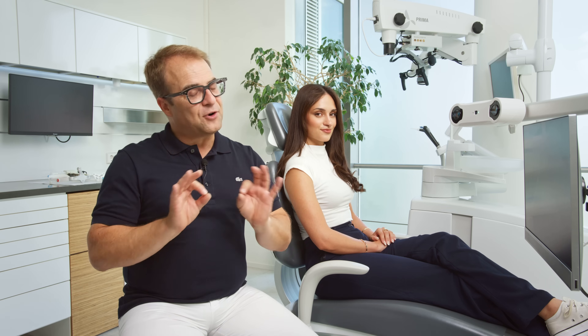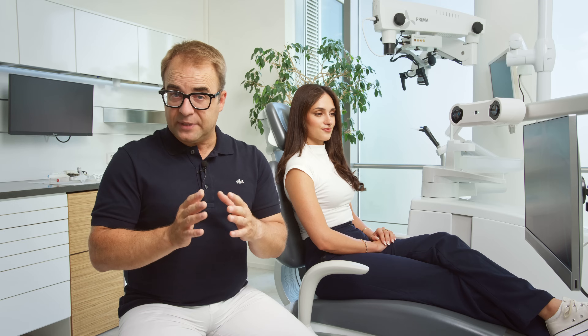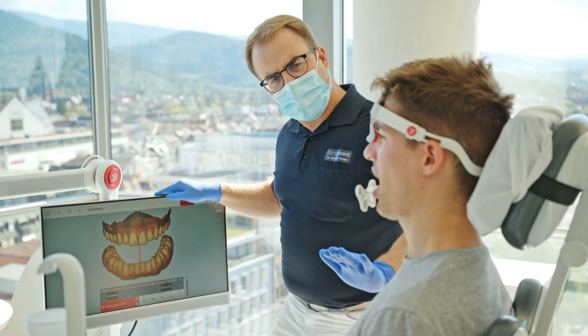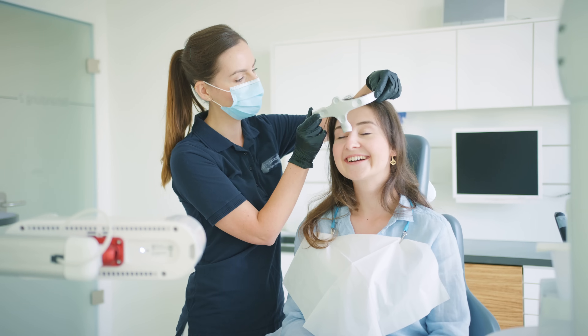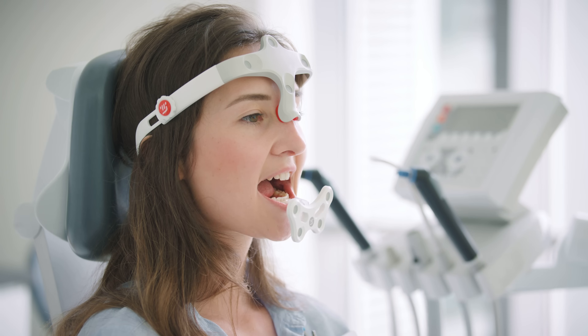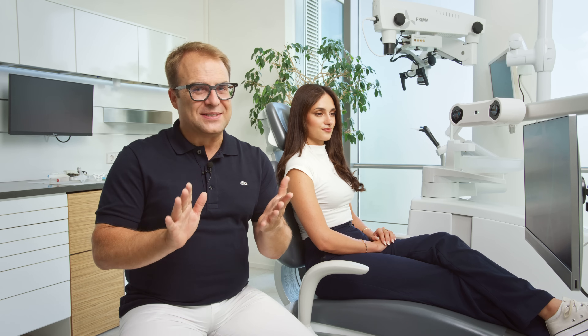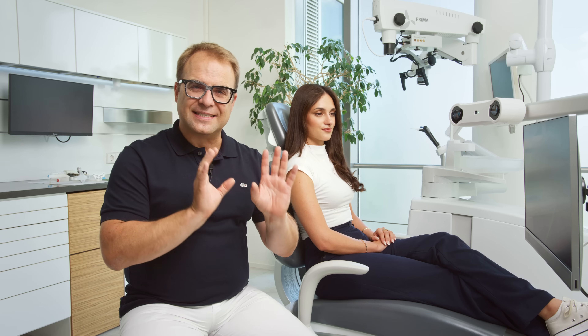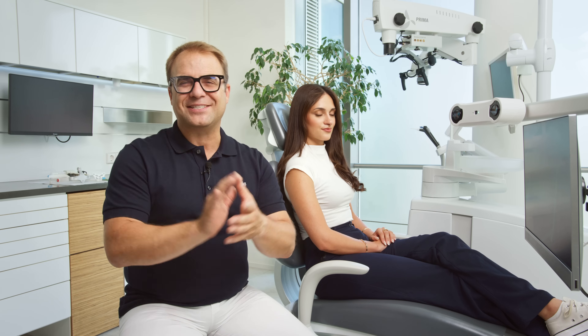We believe that every patient deserves a perfect natural occlusion, whether it's a single crown case, a full mouth reconstruction, or especially a TMD patient. Therefore, jaw motion tracking has become a standard procedure in our clinic. Our teams are performing jaw motion trackings on a daily basis and our patients love it. Today, I am excited to walk you through a jaw motion tracking procedure step by step. Let's get started.